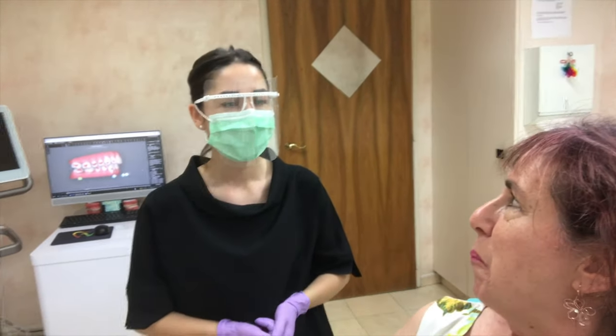Okay, we're back after one month. Last time I was here I had my teeth re-scanned, and now you've received the new aligners. So what are you going to do today? Today I'm going to remove some of your attachments, place new attachments, and give you a whole series of new aligners.